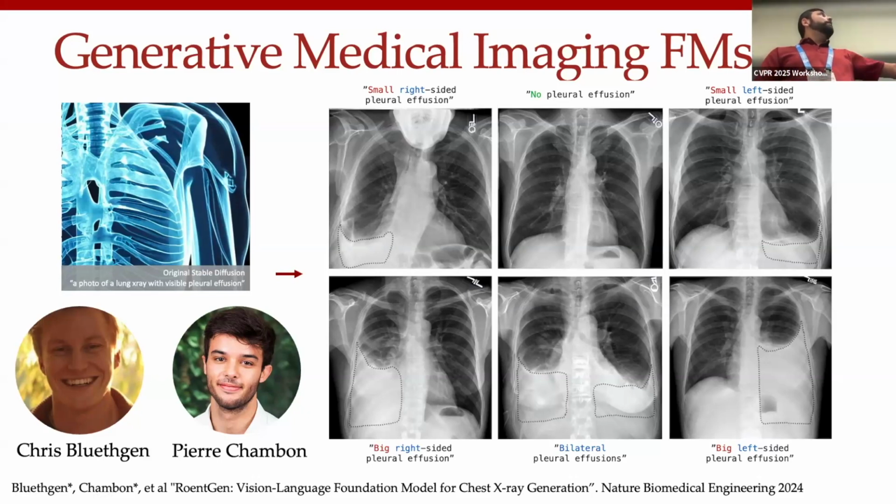And we showed that by using synthetic data, we can actually patch for gaps that our models trained on real data can have. And using different approaches like self-supervised learning or targeted pre-training in a supervised manner, we can really improve the capabilities of a lot of models that are trained on just real data. And we have a new preprint that's coming out that will describe some of those methods over the next few weeks or so.